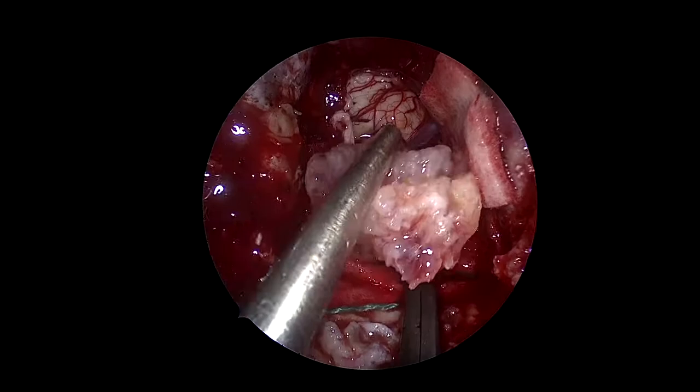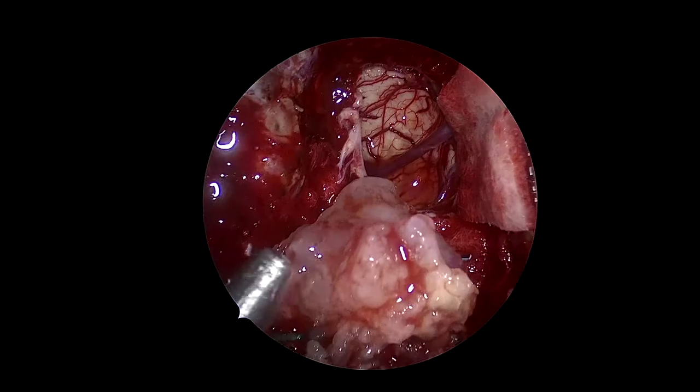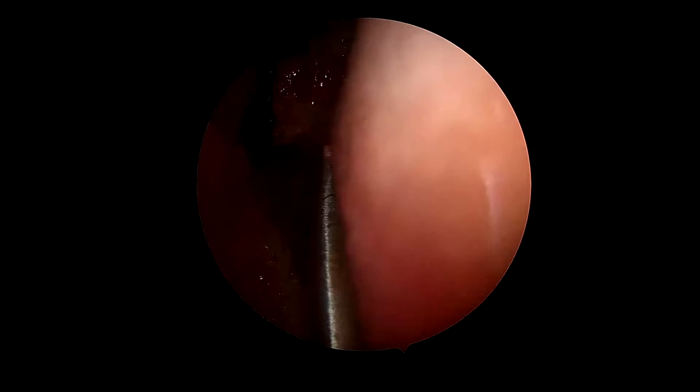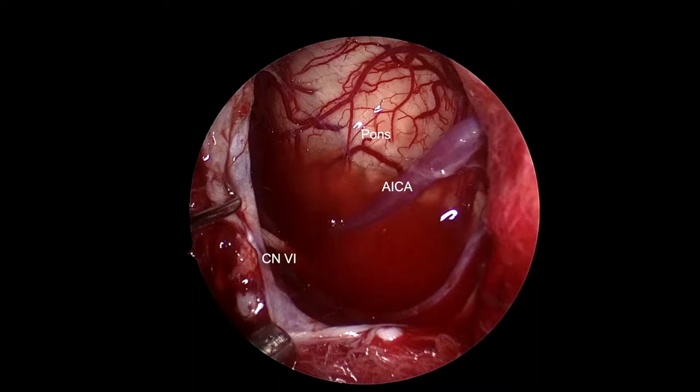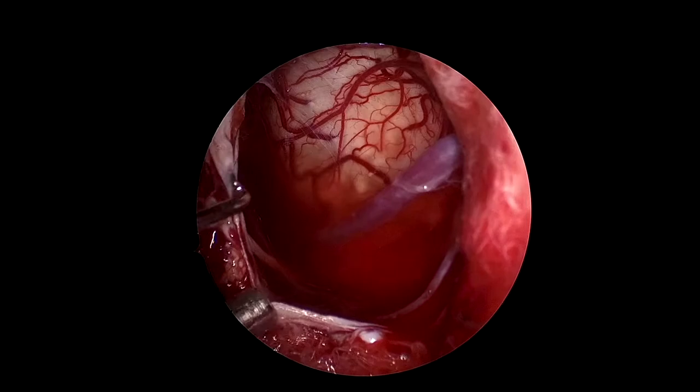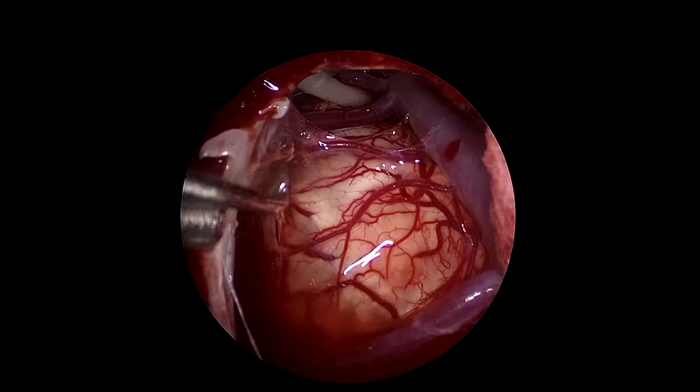You can now appreciate the deformation of the pons caused by the tumor. We are extracting this large piece of tumor to the nasal cavity. We now proceed to identify the location of cranial nerve 6 on the right side. I'm going to proceed to examine where there are any tumor remnants. We look superiorly — this arachnoid looks a bit suspicious, so I gently remove part of it.